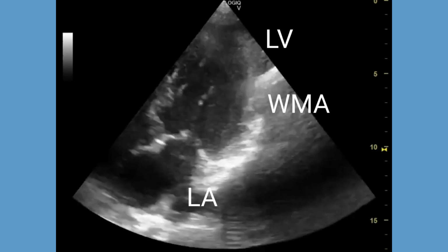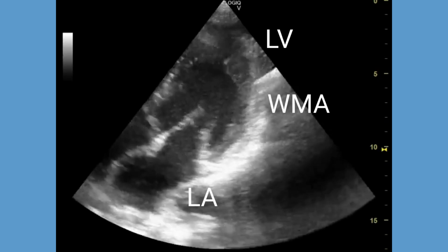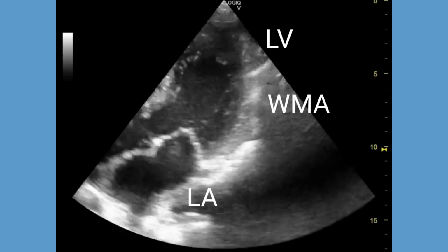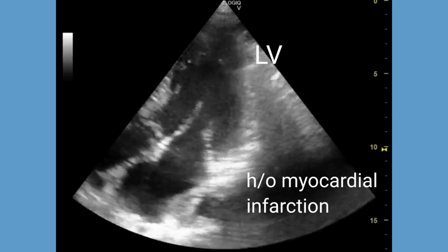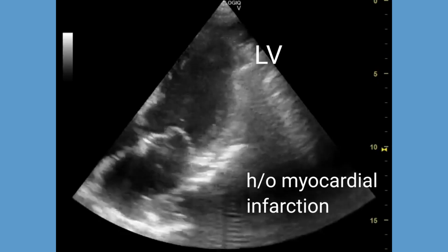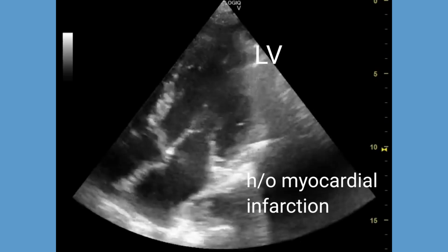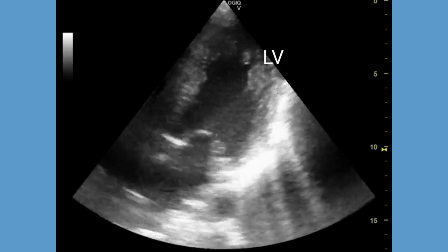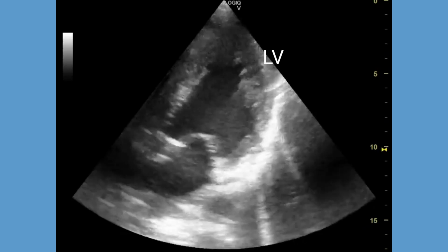The ejection fraction of 32% suggests reduced systolic function, indicating that the heart is pumping out less blood with each contraction than it should. In addition, there are left ventricular wall motion anomalies. The involvement of the left anterior descending artery in the wall motion anomalies indicates regional anomalies in the contraction of the left ventricle. This suggests ischemia or damage to the myocardium in the territory supplied by the LAD.